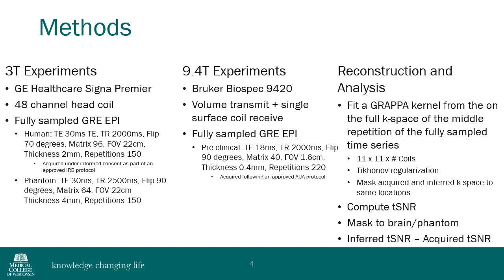The temporal signal-to-noise ratio was computed for each reconstructed dataset, which was then masked to regions of signal intensity above threshold in the traditionally reconstructed image. A point-wise difference in TSNR between GRAPPA R=1 and standard reconstructed datasets was compared with a non-parametric Wilcoxon U-test.